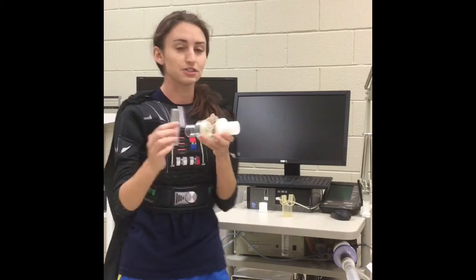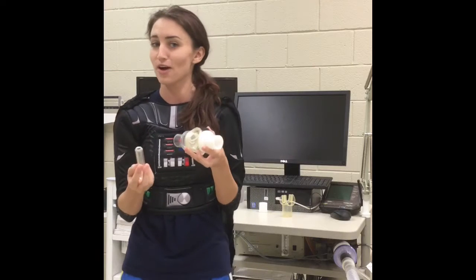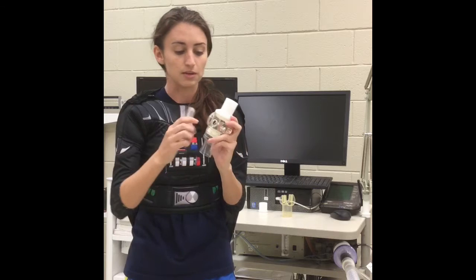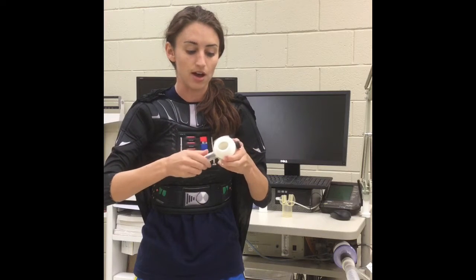Next is the spit valve. When it is in the participant's mouth, spit can accumulate here. It just fits in perfectly on the bottom of the valve.